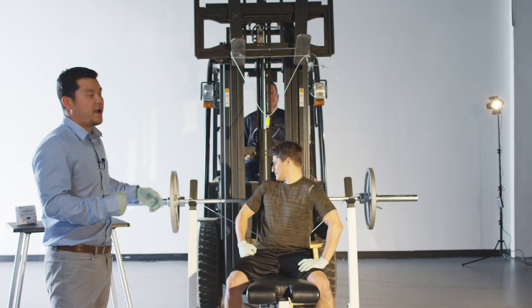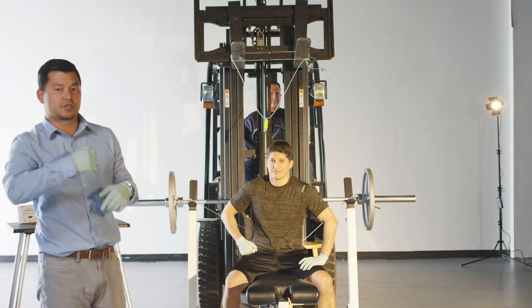Hey there, it's Jason with Tokoyama Dental and today we're testing out our new Universal Adhesive Universal Bond. Behind me, we have 135 pounds on a barbell — the same pressure as that physical force. Let's go check it out.